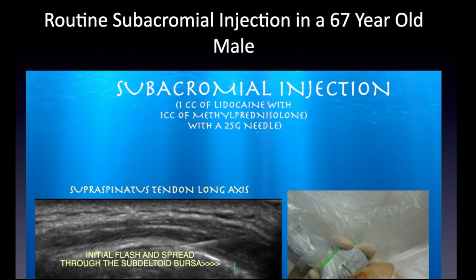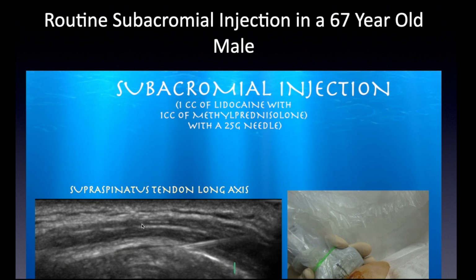So that's just one bit of advice. If you're doing knee injections where the needle is fairly far away from the probe, I would still cover it, but I don't think you have to invest in a sterile probe cover. I think you can just buy a non-sterile probe cover.